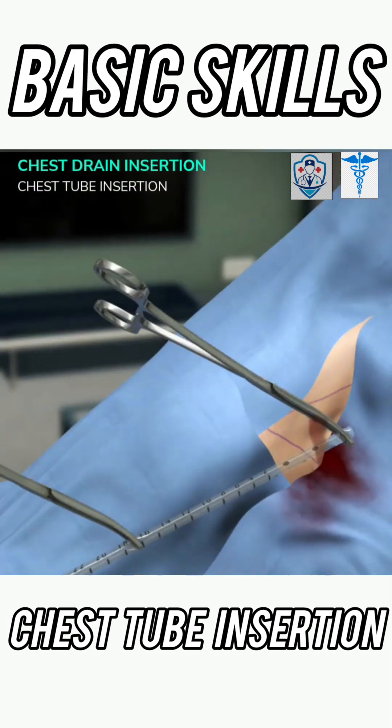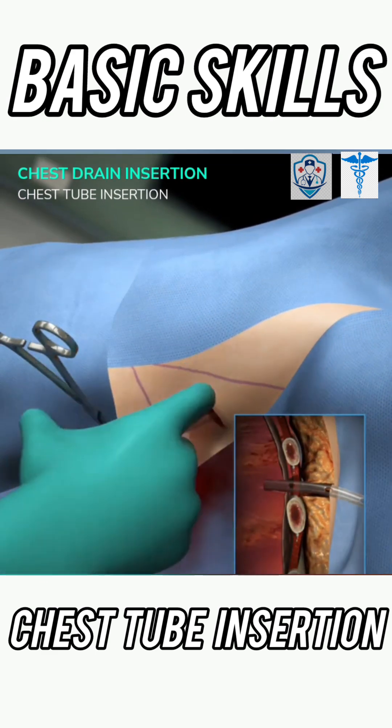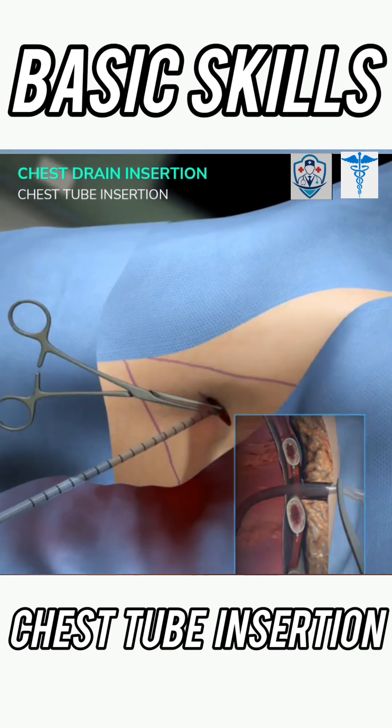To insert the tube into the chest, use 2 clamps held on either side of the tube approximately 20 cm apart from each other. After insertion, use your finger to direct the tube into the appropriate portion of the chest. Make sure all the drain holes are inserted into the pleural cavity.